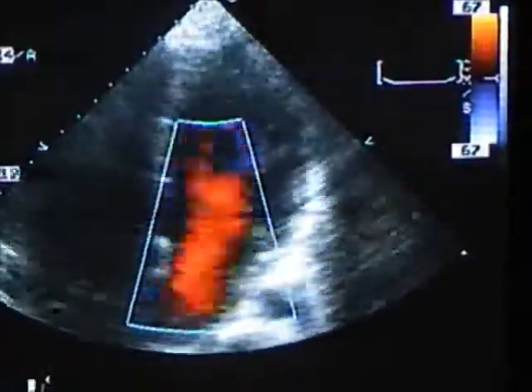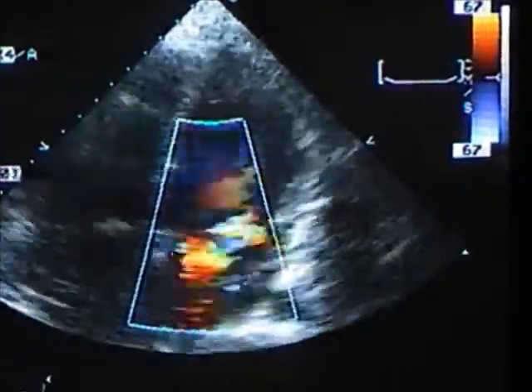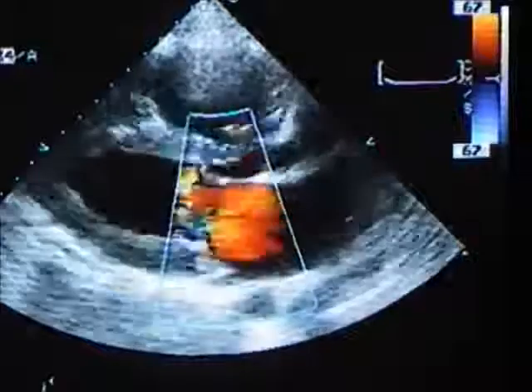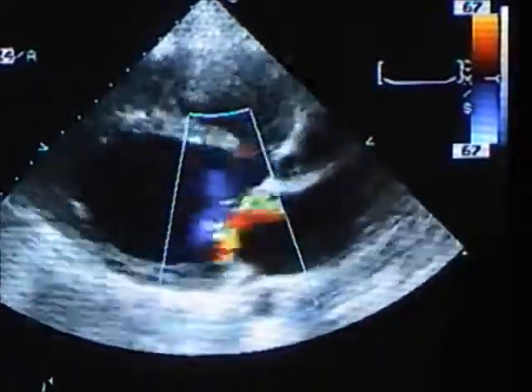For an eccentric regurgitant jet close to the left atrial wall or the ventricular septum, the jet will almost always adhere to the wall. This may cause jet stream flattening, making the jet appear smaller, with consequent underestimation of the measured severity of valvular regurgitation in color flow mapping.